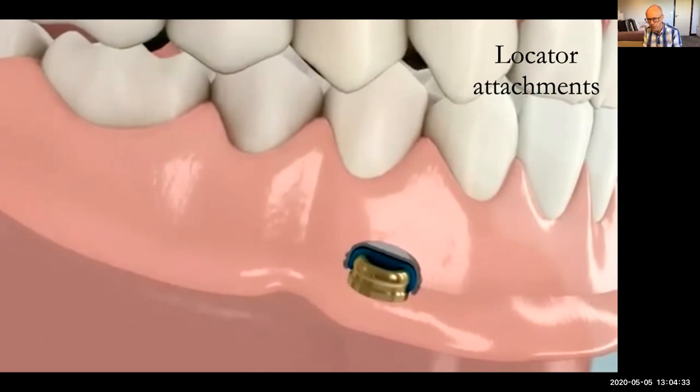Now, they have moved on to the RTX system, and there are quite a few others on the market that are all very similar and operate in the same way, like Novaloc, CM Lock, etc. They all work in just the same way and are really good. So anyway, let's go back to Lynn now and have a look at her.